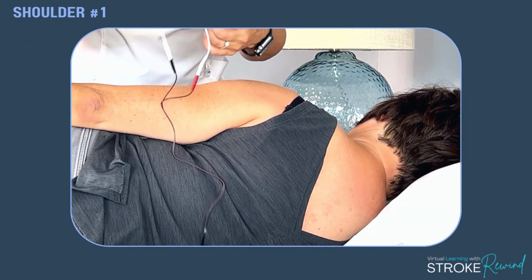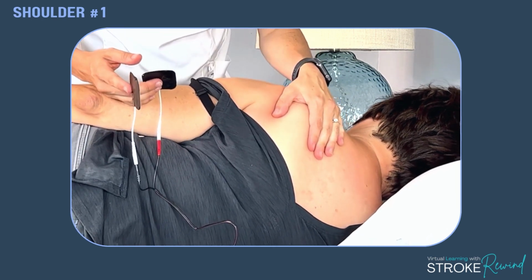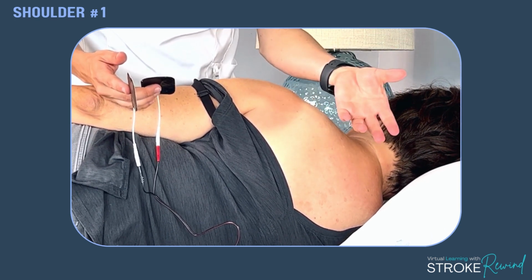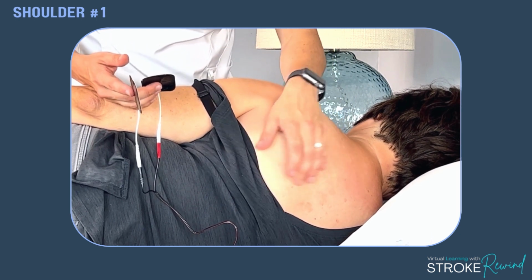Placement number 1, so there's 2 placements I would recommend for the shoulder and the shoulder blade. Again, super effective position. You can do it sitting up or laying down. I do prefer laying down. I think you get a little bit more access to the muscle, but you can do it either way.